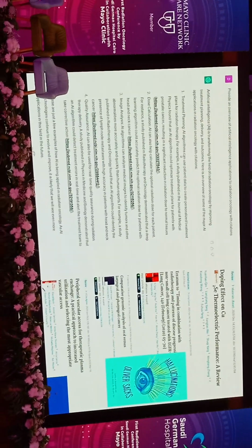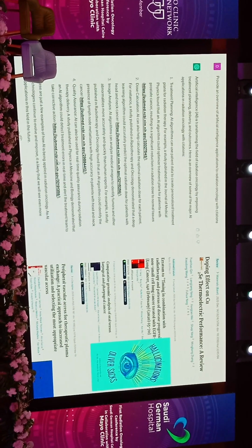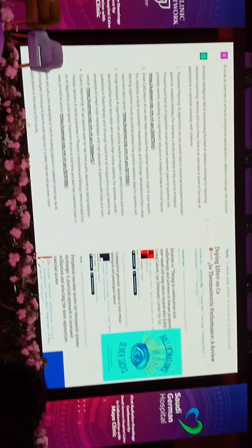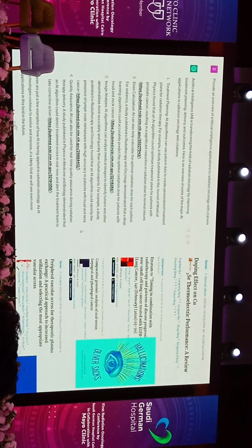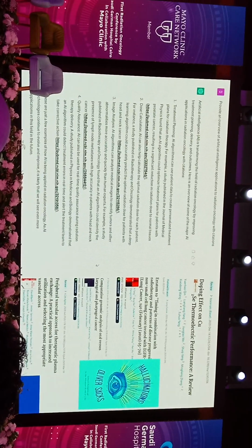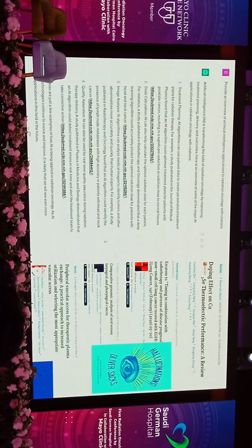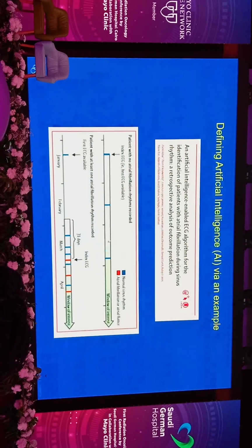But nevertheless, the citations did not go to relevant articles. And I tried to correct ChatGPT by saying these are mistaken links, and it still gave me links that don't make sense. So ChatGPT can have hallucinations and errors, and auto-segmentation can have hallucinations and errors in a way that a human normally may not make a mistake. And so the modes of failure are different, even if they happen less often. And so we need robust quality assurance in place.